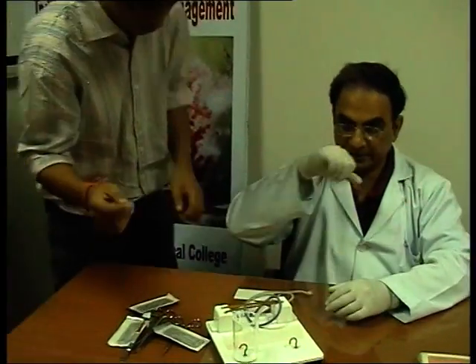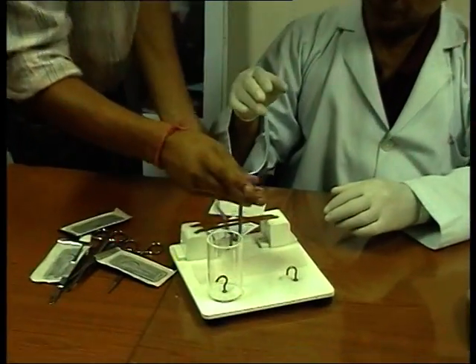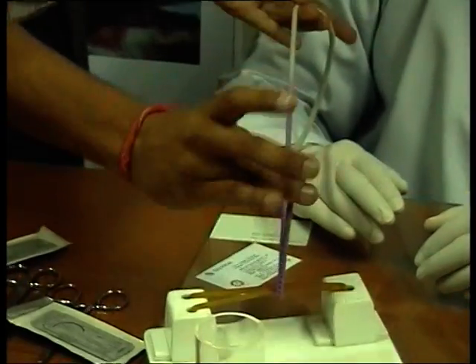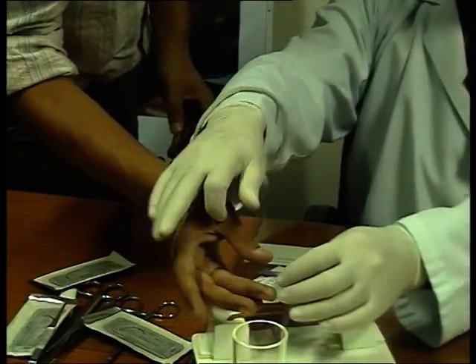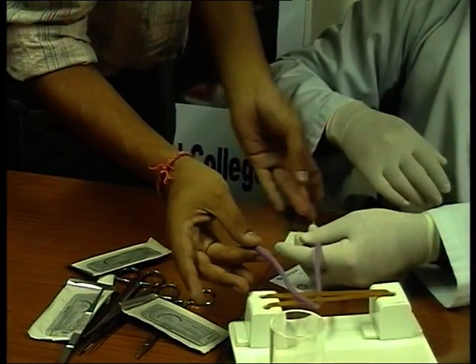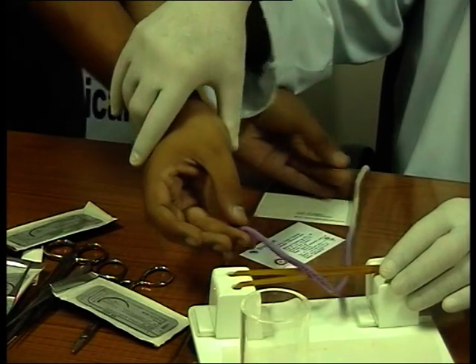The short end is away. Hold it with the ring finger and the thumb. So then we cross. See, the problem here is actually you have to hold somewhere. Okay. Now hold this with the ring and the thumb. Don't be afraid. You don't have to worry about it.